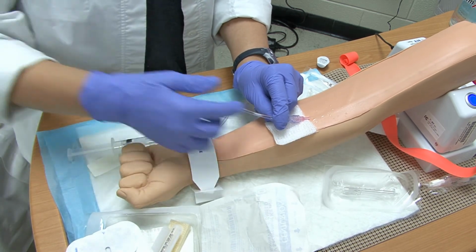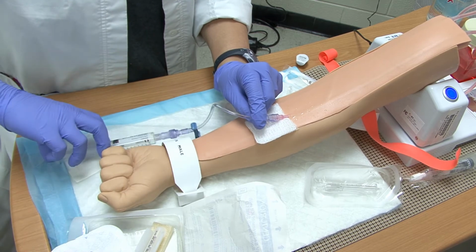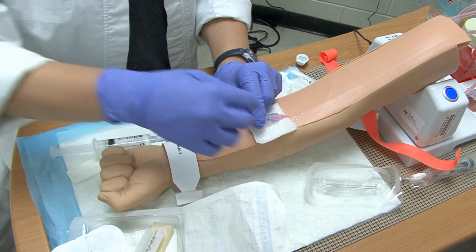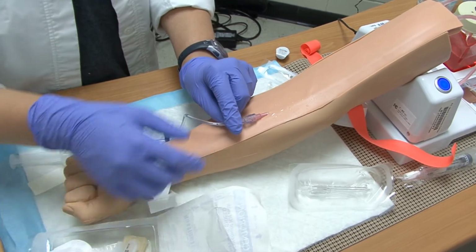You can pull back, and you'll be looking for what we call flash or blood return here in your actual extension set, and then you can continue flushing. And as long as it flushes without difficulty, and you don't have any swelling or issues up here at the site, you can now come and you can take your gauze out.